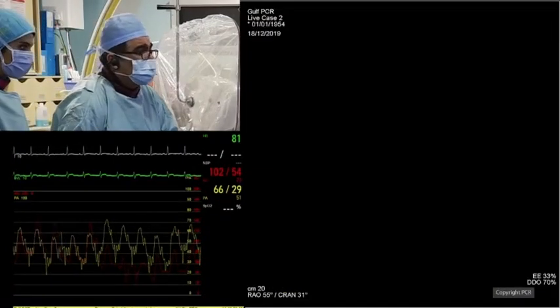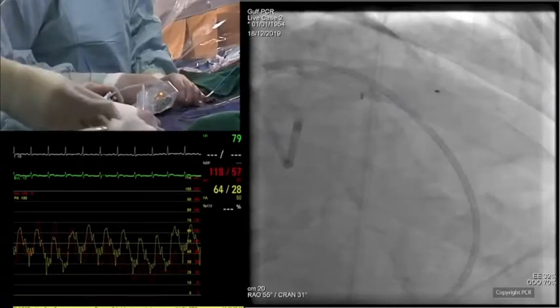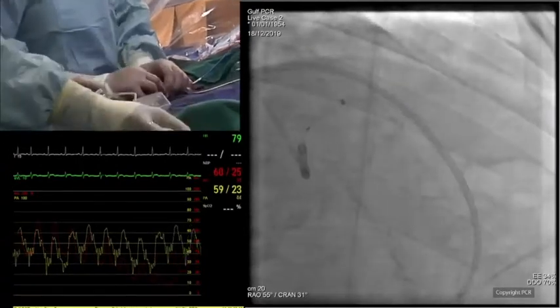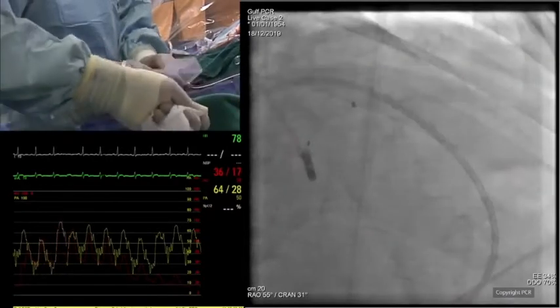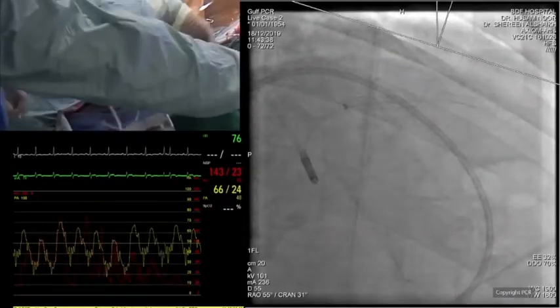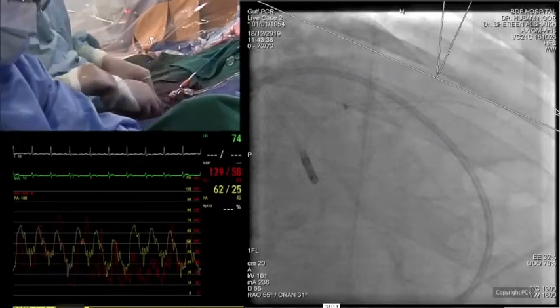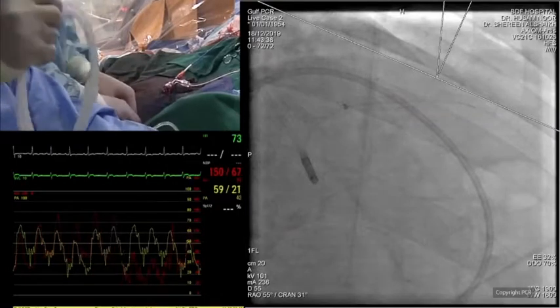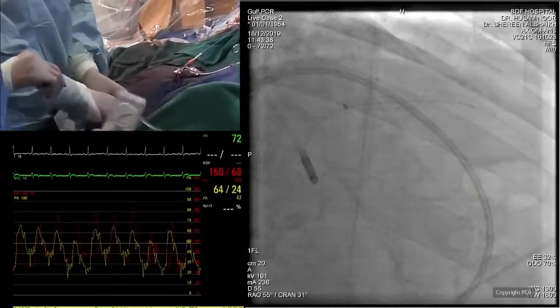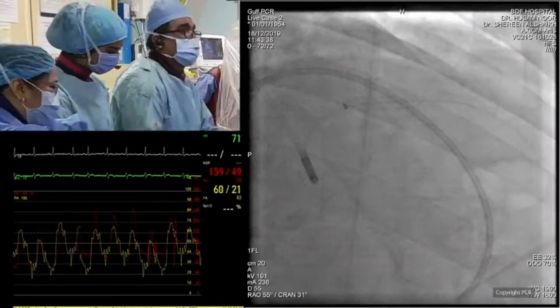Yeah, thank you. So I also took this advantage. I'm going to put the guide liner inside the stent so I would not damage it later on if I need to, because I need to post-dilate a little bit. So that's there. Give me a 3.0 non-compliant balloon. I think that was important because you had an angulation in the LAD, and that was causing the problem. So the guide liner was essential to be beyond that angulation. That was important. Yeah.